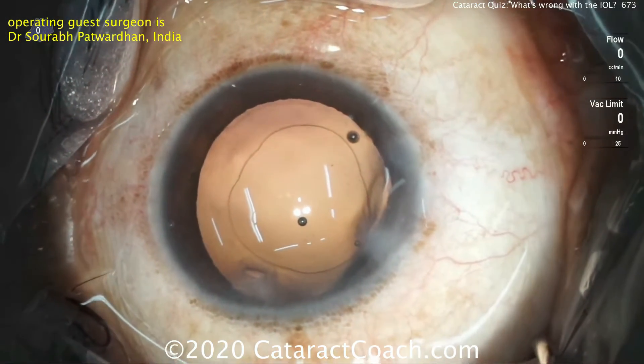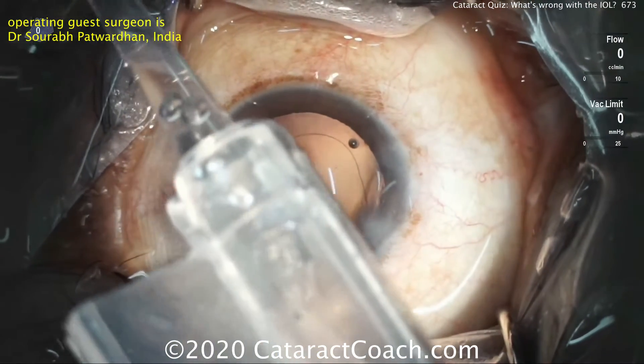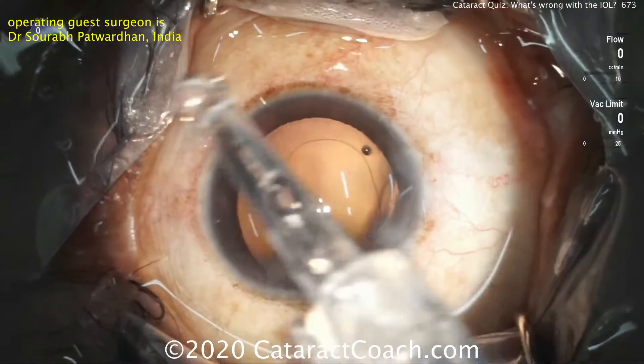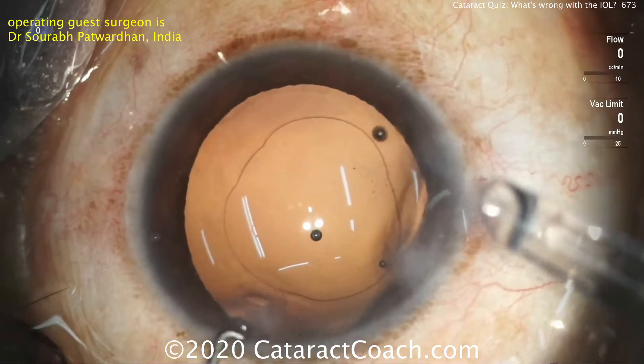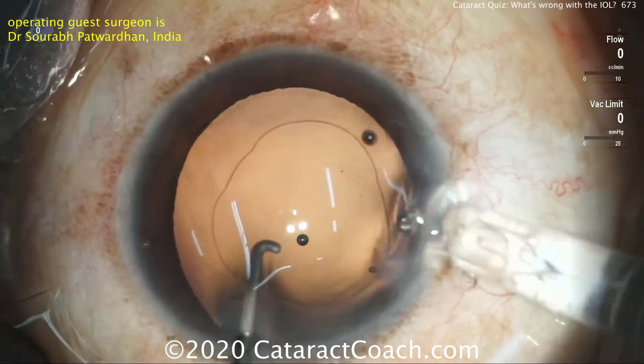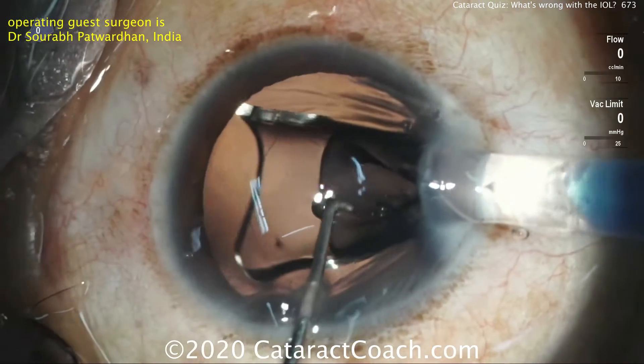And again, up until this point, totally normal case — normal zonules, normal everything. There's the injector with the IOL loaded up inside. A little fixation of the eye through the side port using that second instrument, delivering the lens in the bag. Look carefully — what do you think?